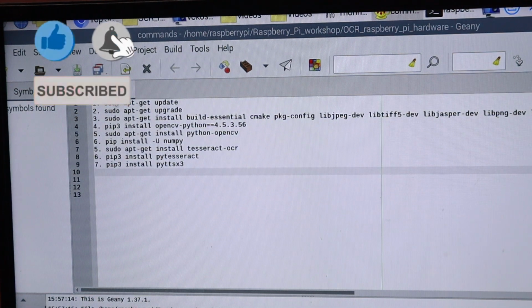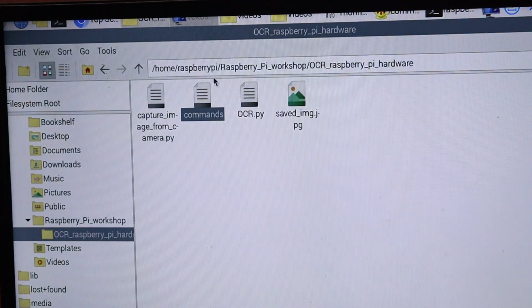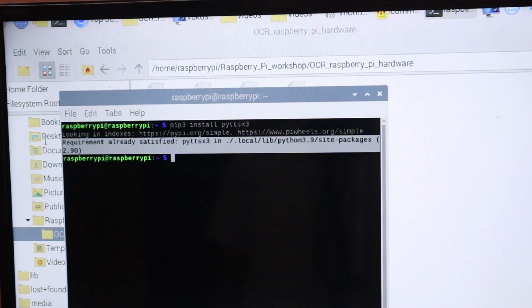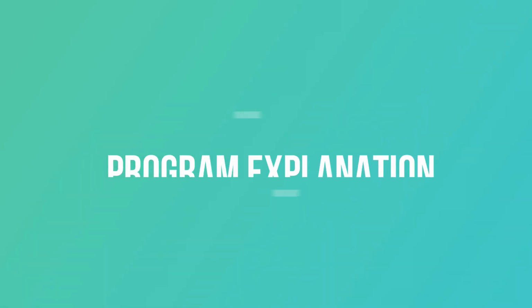You can access the commands from the command file. You can see the command file is here already. In this way you can install all these libraries. Now we will see the program explanation of this same project. Once you install the commands, at my end it is already installed, so it is showing 'Requirement already satisfied', but in your case it will install all these packages. In this way you can install them one by one on the Raspberry Pi.